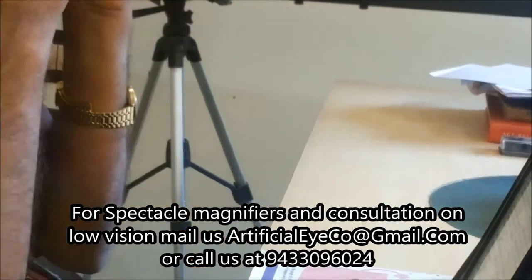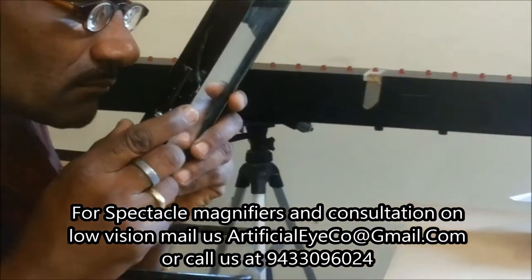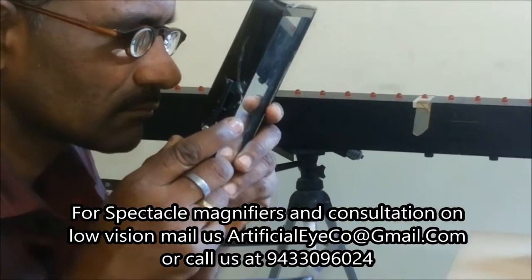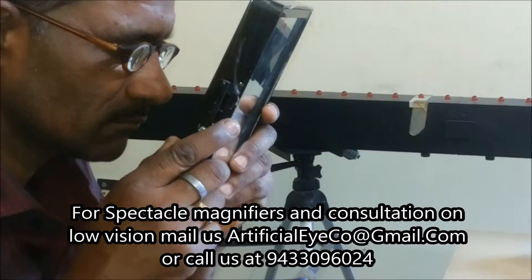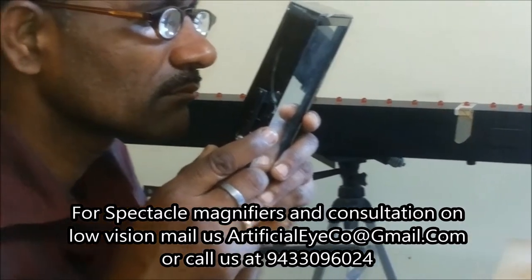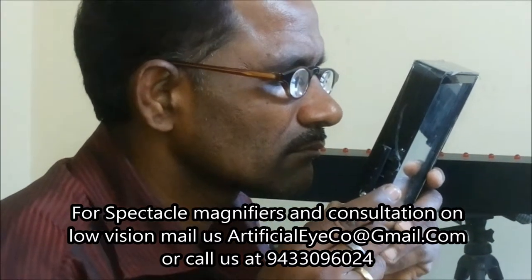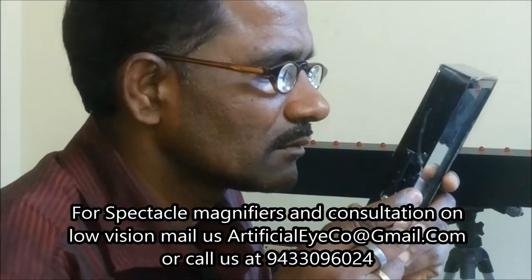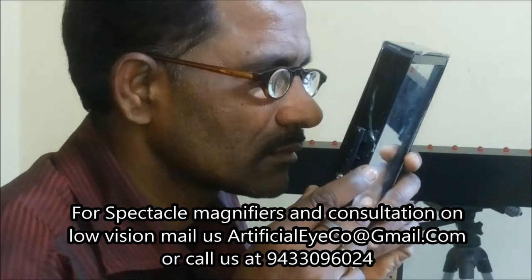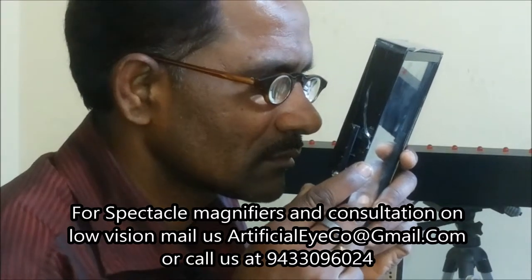Once the patient wears this type of magnifier, he lifts the paper or the text that he wants to read and brings it closer to his eye to read. Depending on the magnification given in this spectacle, the distance will vary.